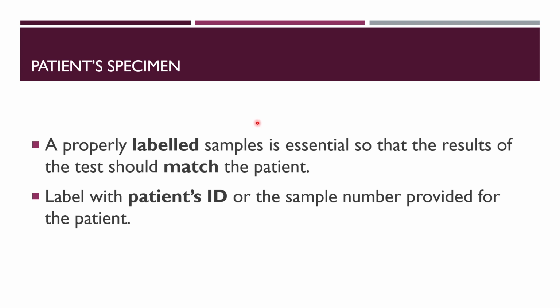Like in some conditions the same name may visit your lab, such as Rakesh. So Rakesh can be multiple persons having the name Rakesh. So you cannot label just the name Rakesh on the test tube, or you can say vials.